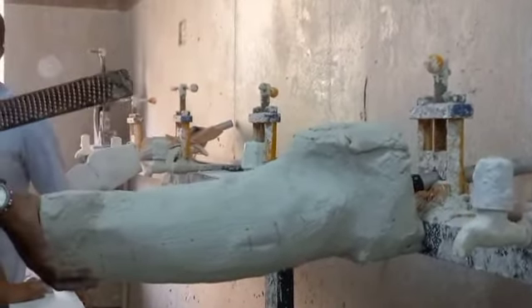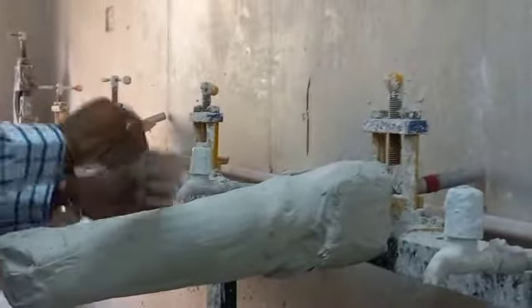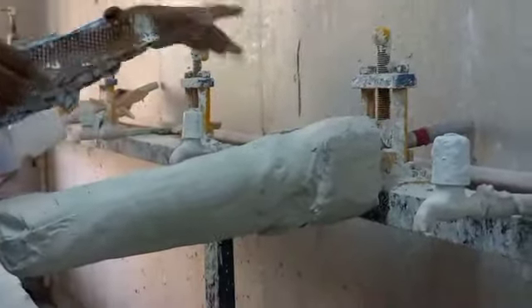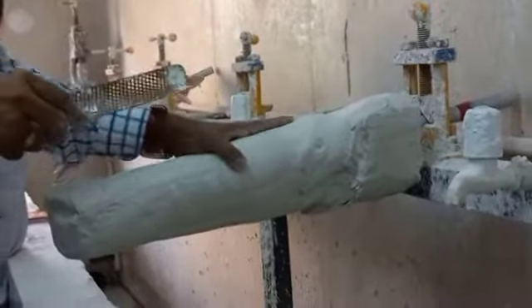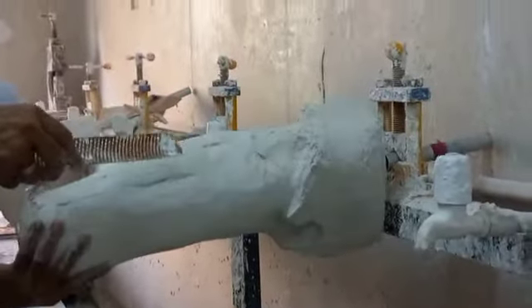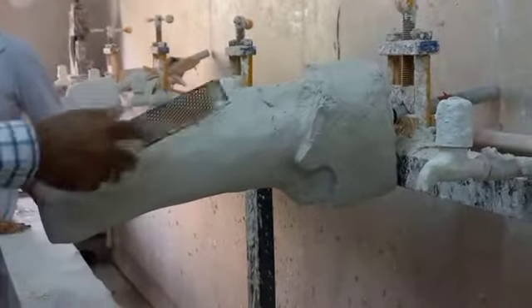The main thing you all please listen to again and understand: the precautions that you take while taking the measurement over the patient, and you just try to compare it with the positive mold as it is. Second is to keep the shape as much the same as possible, do not change the shape, so that you get the loading proper. The patient will be more comfortable.